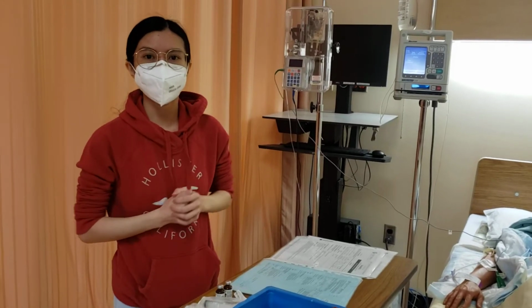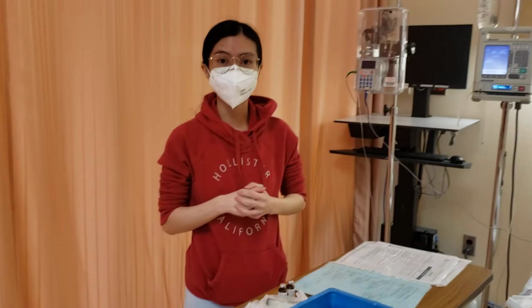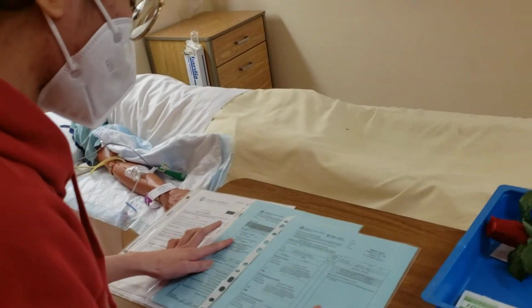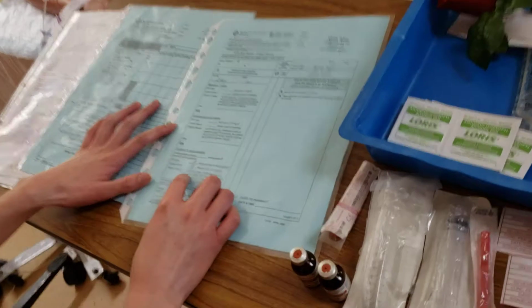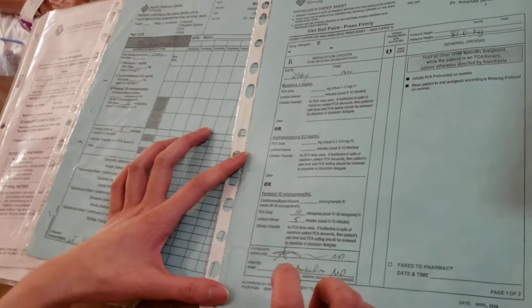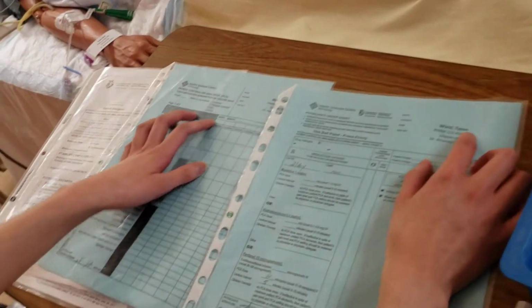We're going to do PCA for pain medication for my patient. First we're going to look at the doctor's order and the patient's MAR. From the doctor's order, they gave an order for fentanyl, 10 micrograms, with a lockout of 5 minutes. There's the physician's signature and another nurse for transcribed, and it's for Ward Tyson.